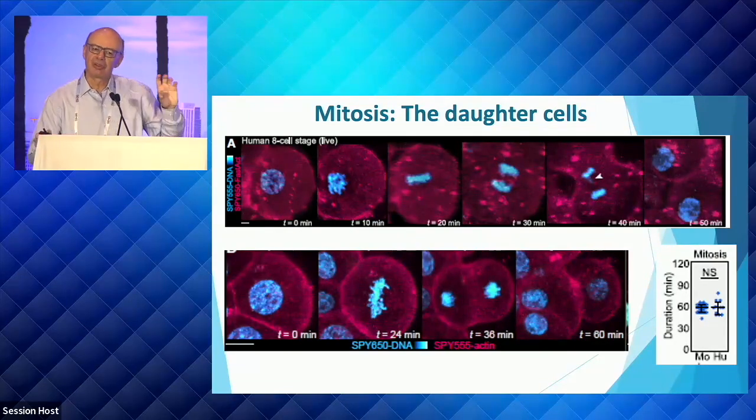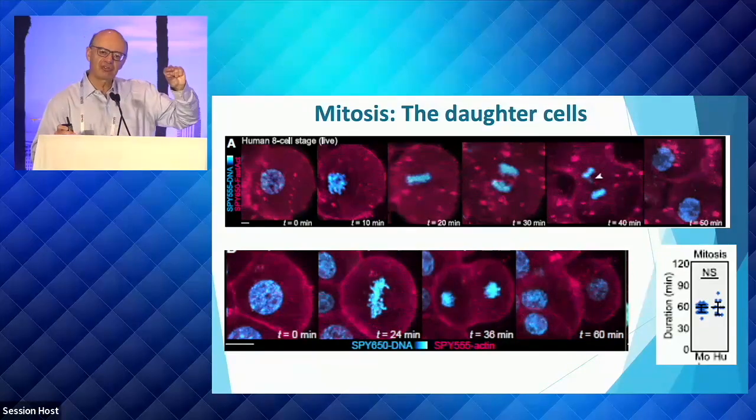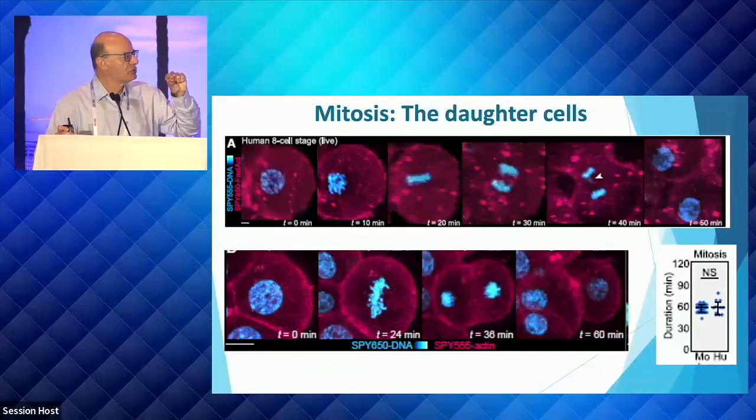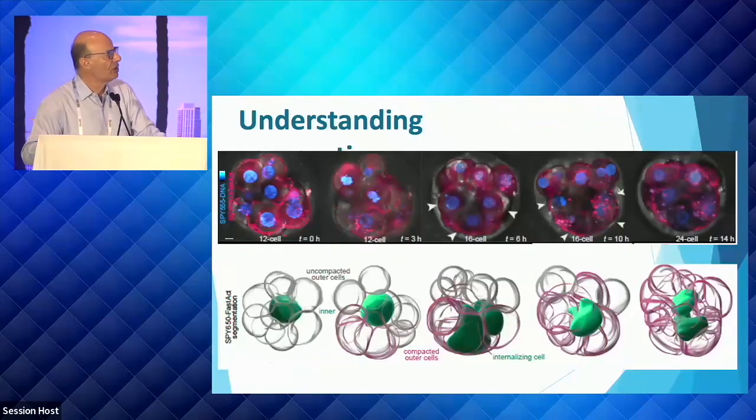And one of the interesting things we saw, which maybe is not that surprising, in the bottom right-hand side, you can see the mouse duration of mitosis is much tighter compared to human. And that we also see with time-lapse. So we're learning a lot with these.